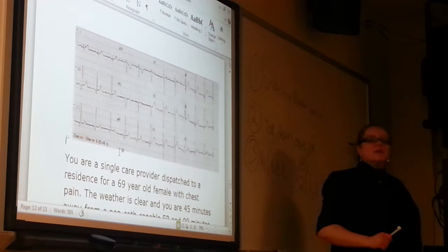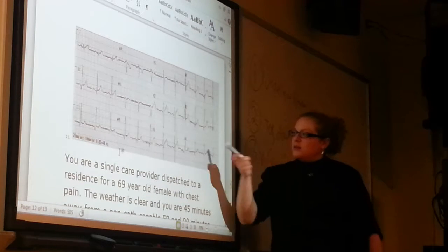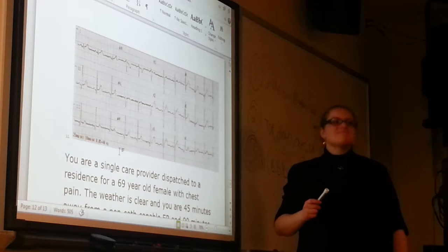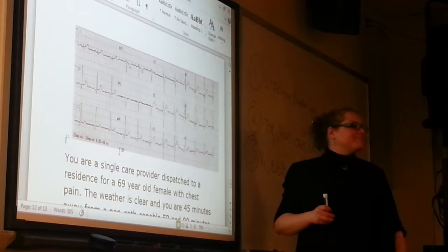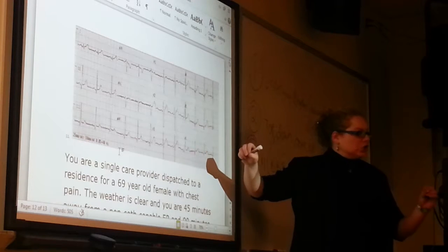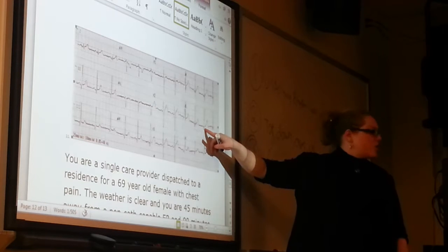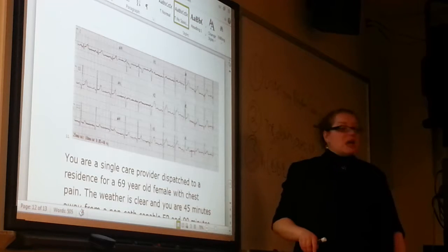The ST segment there is kind of raised a little above where the T wave eventually comes down to. It looks to be about a box. This looks like it might be a J point. When you see this little hook thing, does everyone see that? How it's darker at the very beginning of our ST segment, at the end of the QRS complex? Does everyone see it? I need yes or no. Okay. Right here, this very well could be a J point.